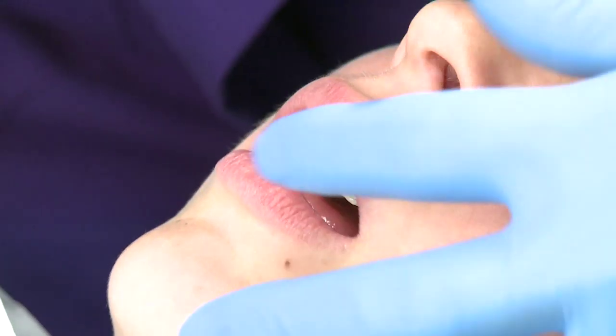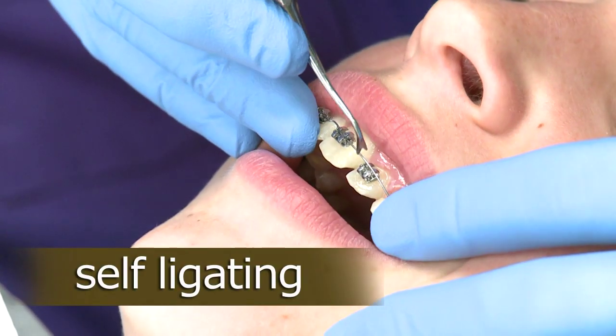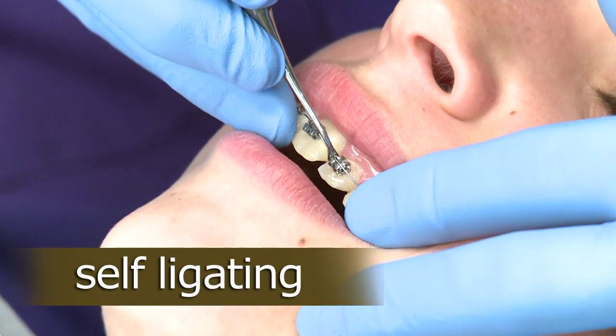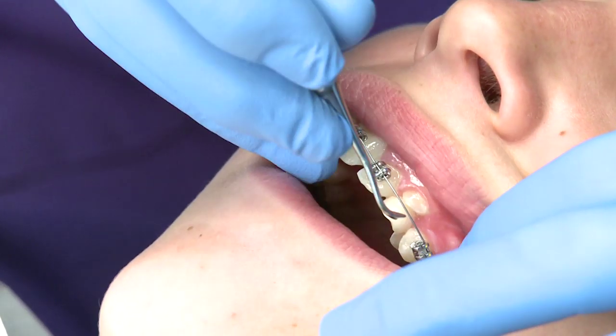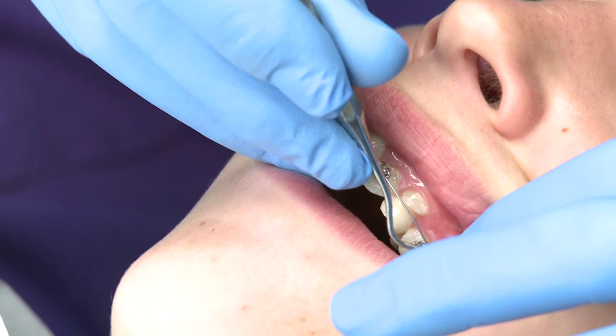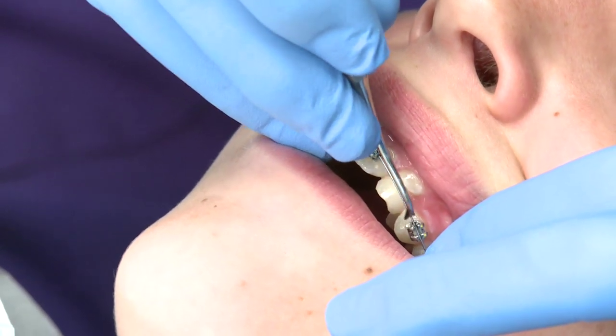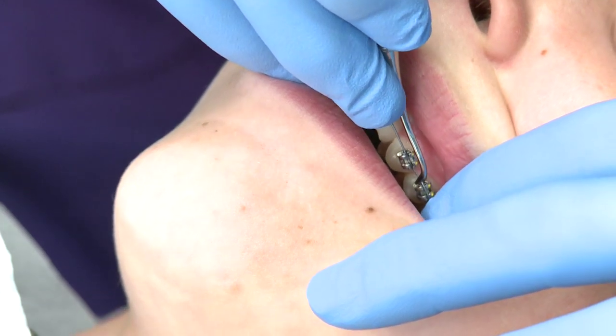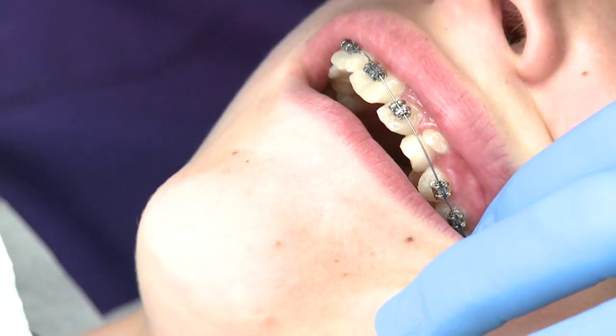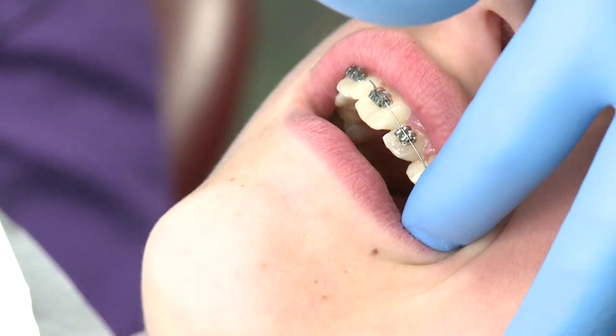The type of braces we use are called self-ligating braces. This means each bracket has clips built in to hold the wire in the bracket. Since the wire floats in the clips, it creates less pressure, which makes wearing your braces more comfortable and more efficient. This bracket system is also much easier to keep clean.